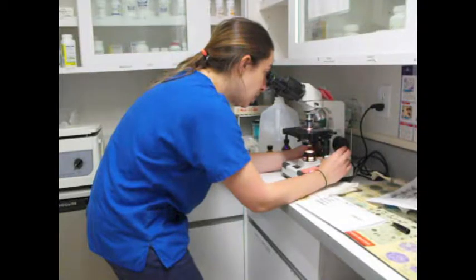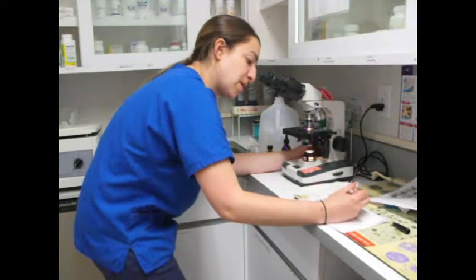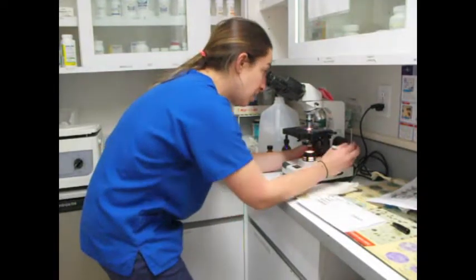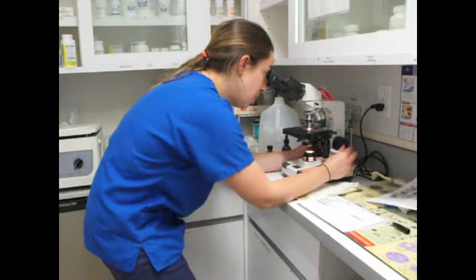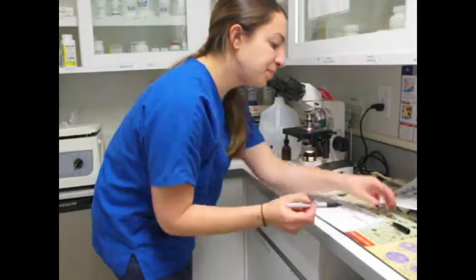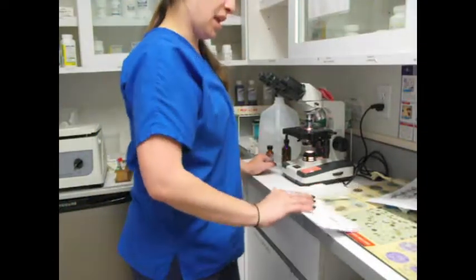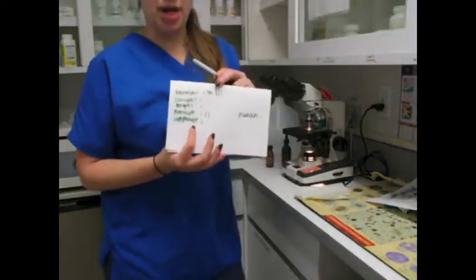And I see 2 monocytes. And you know what? That one in the corner up there is also a neutrophil. Okay. So in my one field, I have counted 8 neutrophils and 2 monocytes.